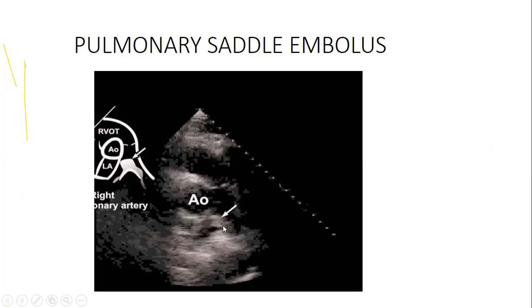When you see here, there is an echogenic lesion. So this can actually help you to pick an embolus. It's very difficult on echo to pick an embolus beyond this level, because the diameter of the arteries down here is very narrow. So you pick it around here. It's a common site for an embolus, which can be visualized on echo. So echo plays a role even before you suggest going to the cath lab. It can help you to pick something, but beyond that, you cannot see.